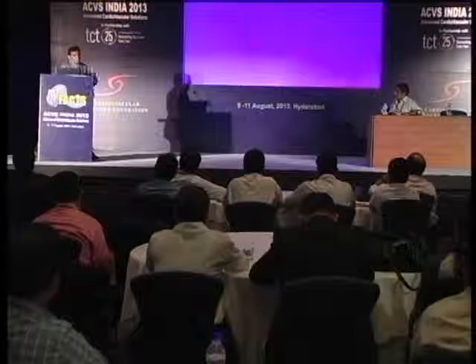Right. Silverhawks, from LS to DS, there's a wide range of sizes that you use for peripheral vascular disease. But for coronary indication, SS, ES, and DS are the only ones that can be used, because anything bigger than that doesn't fit in an 8 French system or lower.